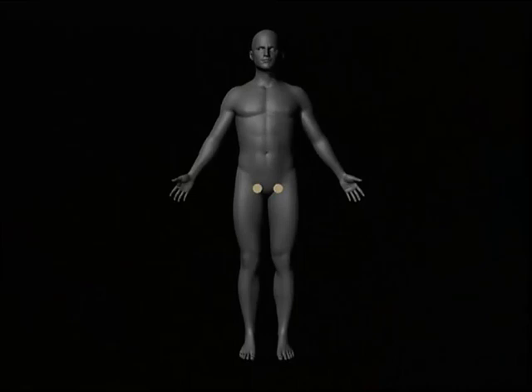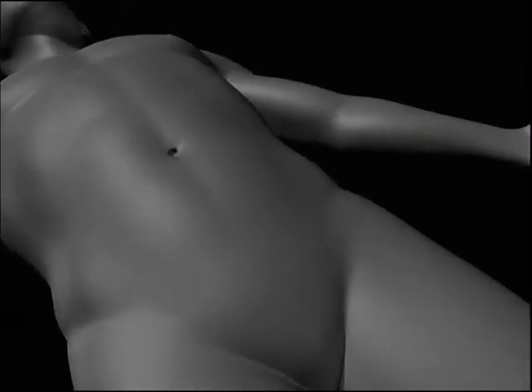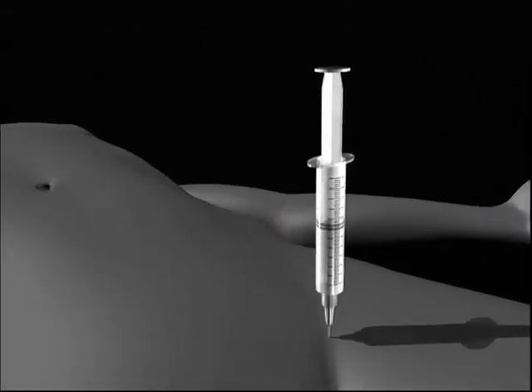The femoral artery may be used to obtain an arterial blood specimen when neither radial nor brachial access is an option, as during CPR. Located in the groin area of the leg, punctures to this site should only be performed by a physician or qualified emergency personnel trained in this procedure.